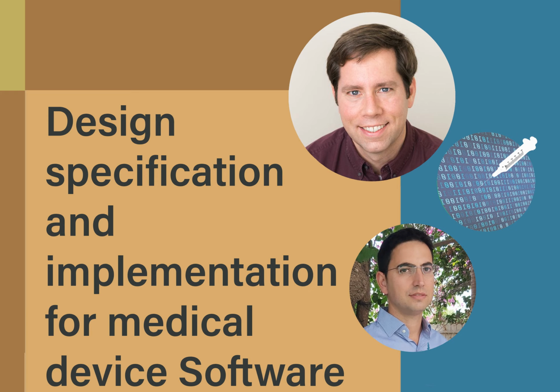Do you mean that, let's say, the SRS, the requirements? Yes. For us to do a software detailed design, we need the SRS as the design input, and the design output is the detailed design document. Is that a fair statement? Yes. And then that design output, that detailed software design, is itself the design input for the implementation stage. Is that a fair point?